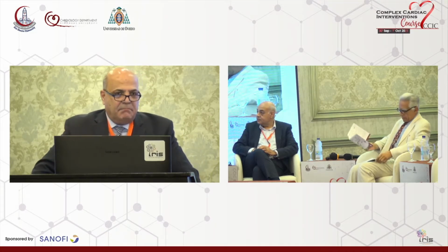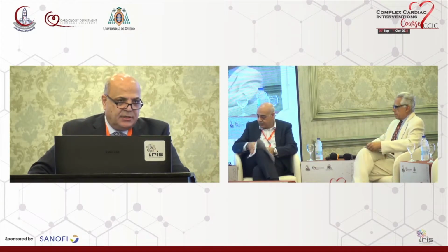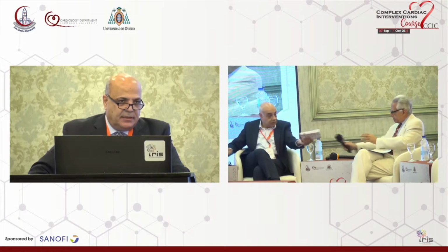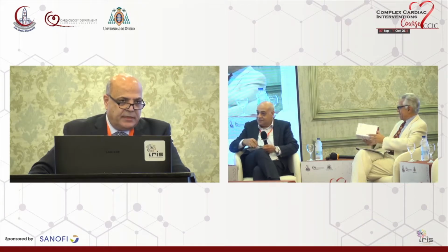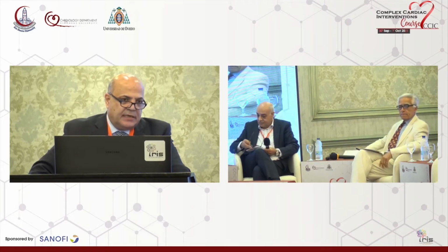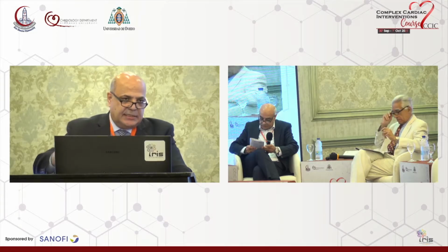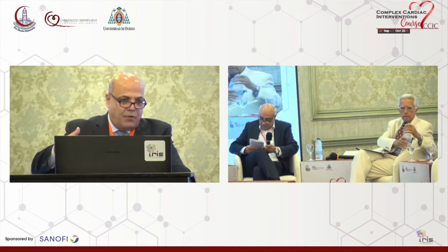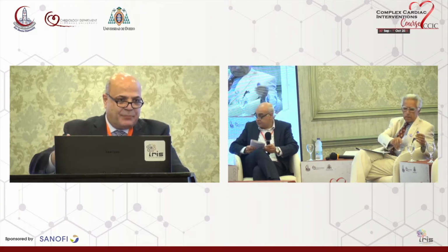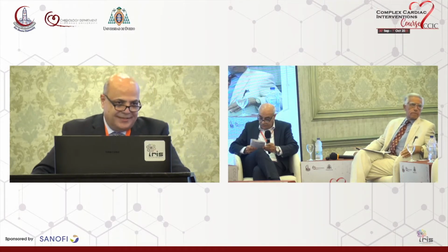Actually, in one of the views I showed, there was a proximal edge dissection after stent deployment in the LAD. And this edge dissection compromised the proximal part of the LAD. That's why I omitted the FFR. And if it's an ostial LAD, then the decision is to go for left main intervention. And with left main intervention, why not do the circumflex as well? Actually, the procedure was driving me. I was not the driver. The procedure was driving me to this way of management. Thank you.